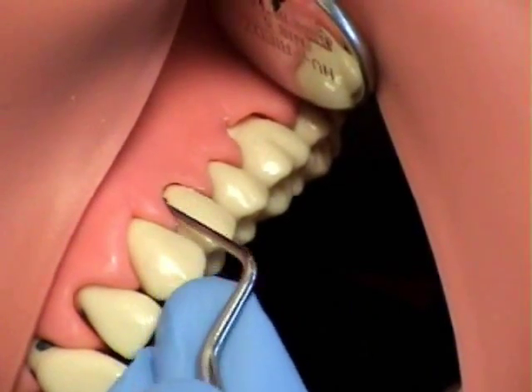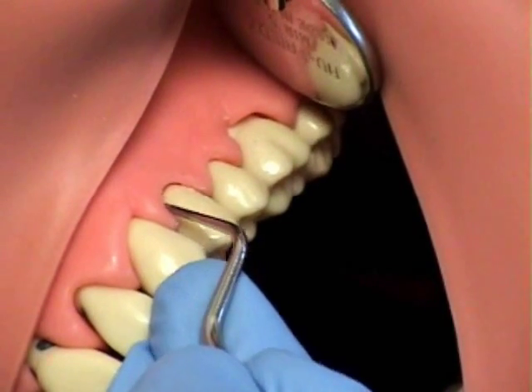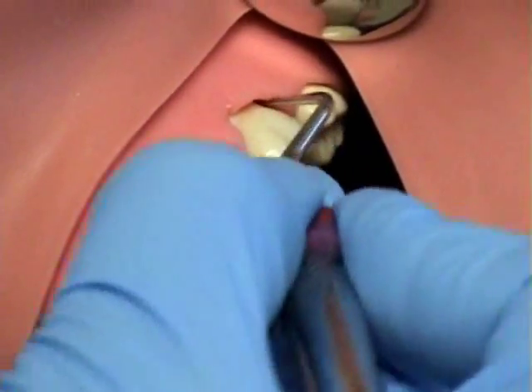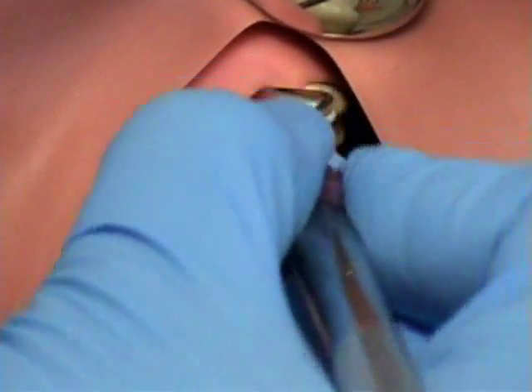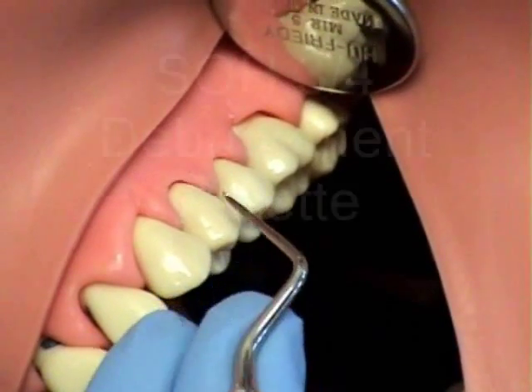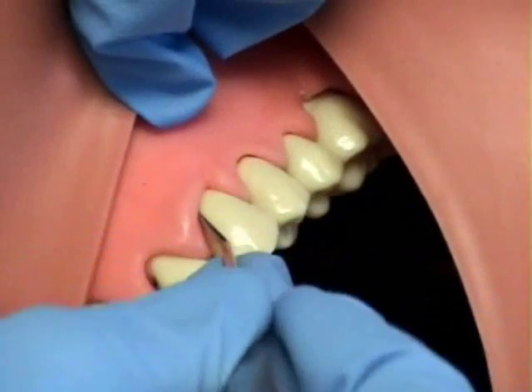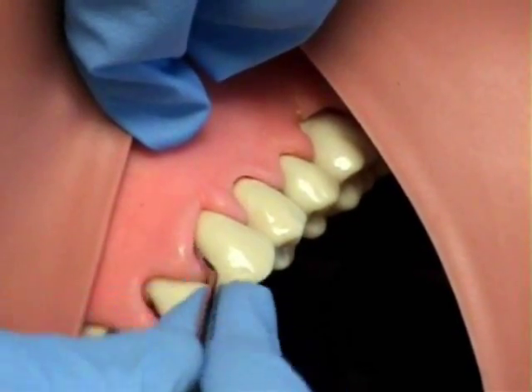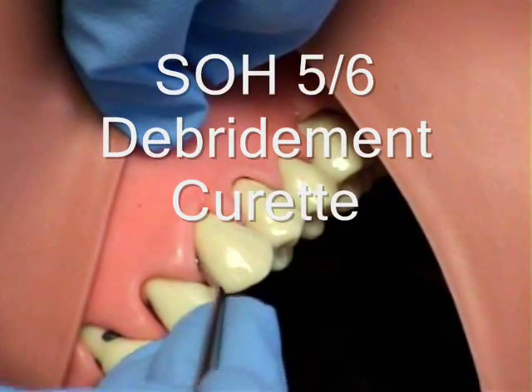The SOH34 is used for mesial and distal surfaces. The proximal debridement curette is the SOH34. The anterior debridement curette is the SOH56. It has an 8 mm shank and is angled to access all tooth surfaces.